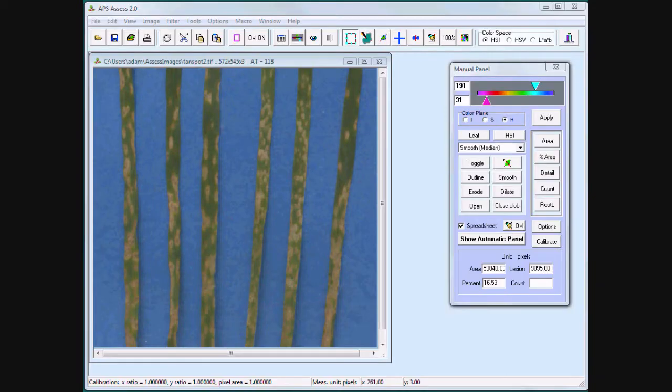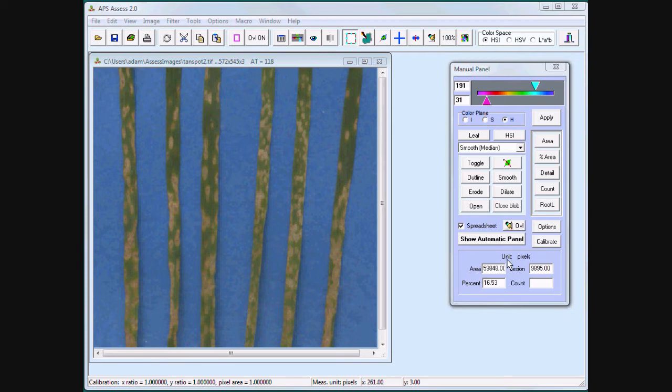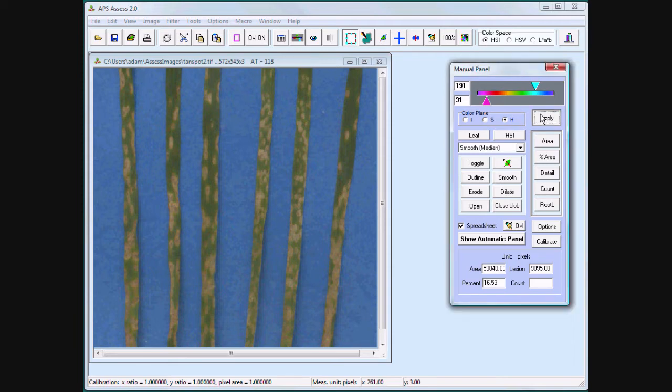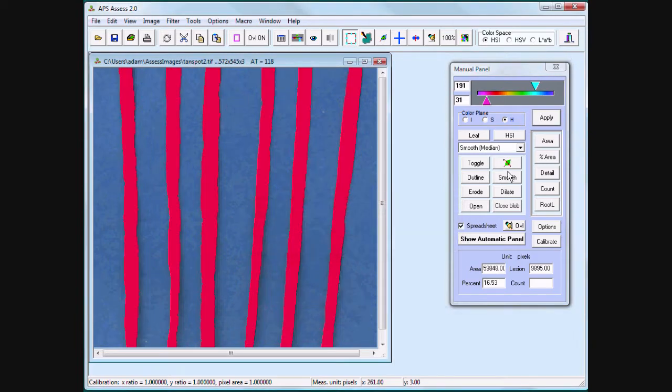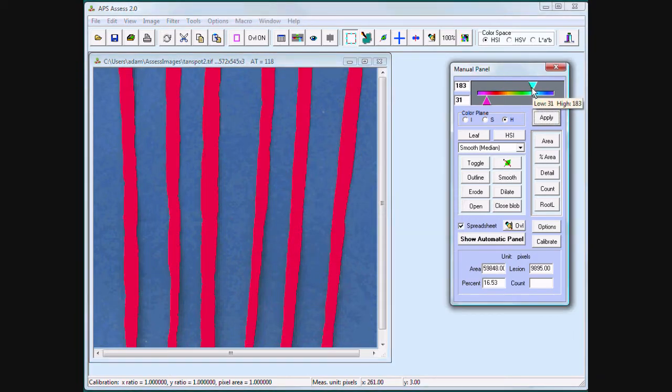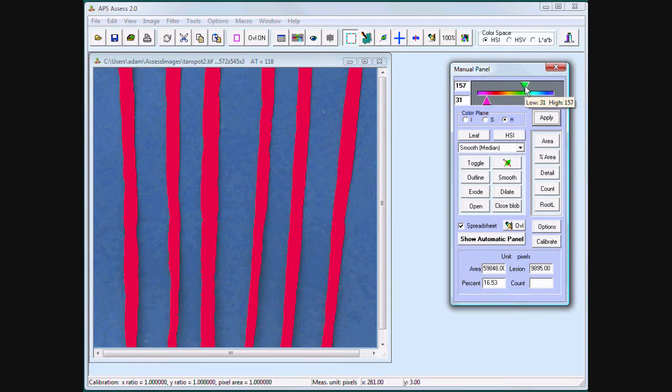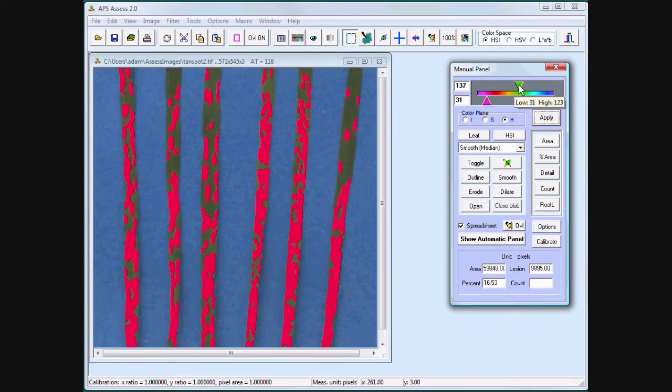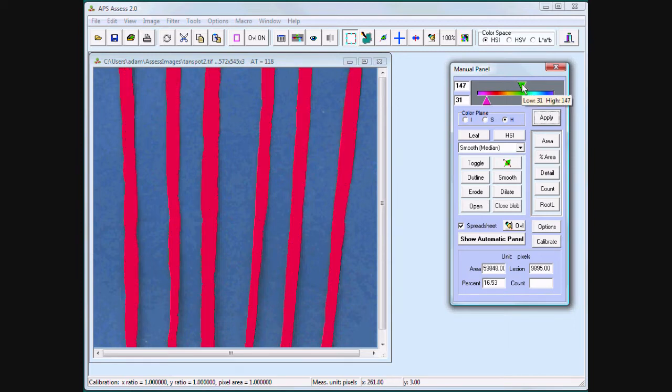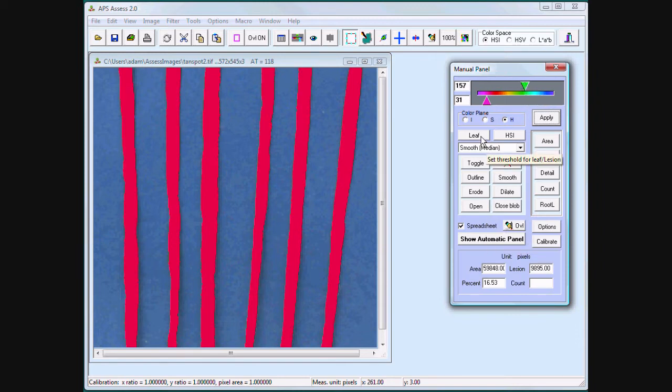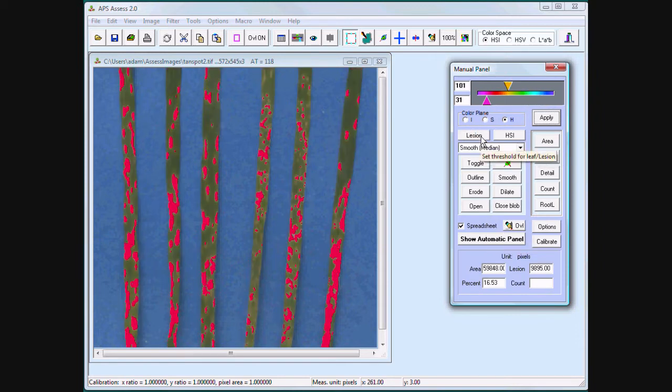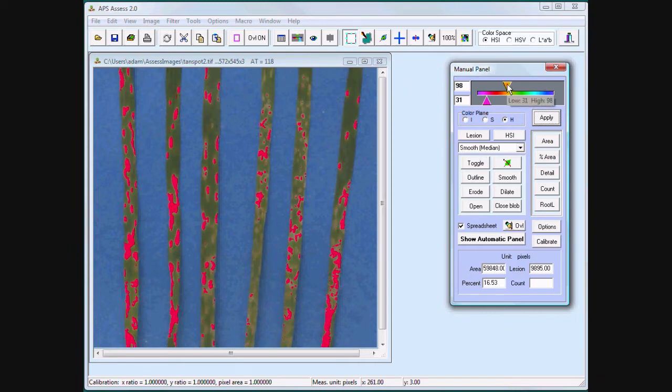Assess's Detail option can still be used with manual thresholding. I have this image with multiple leaves, HSI color space. Threshold my leaves with the hue, threshold the lesions with hue.